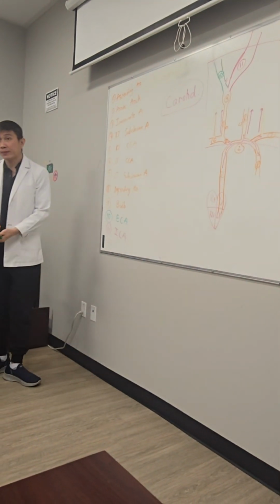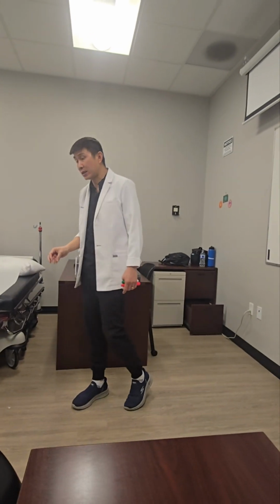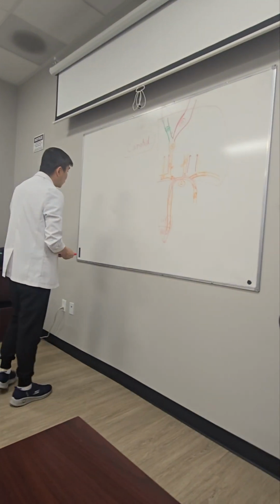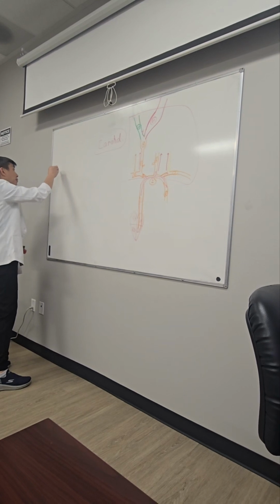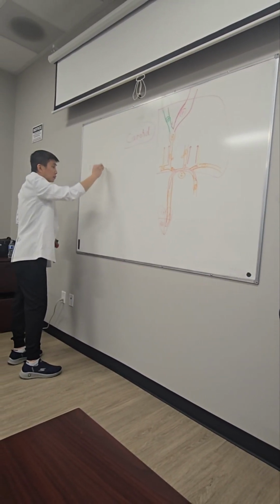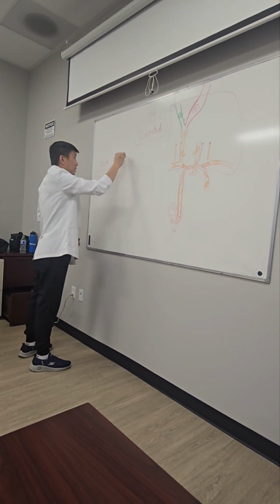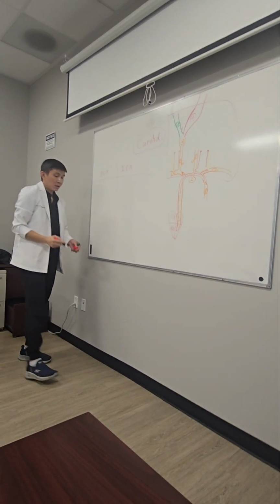So to differentiate between the ECA and ICA, I'm going to help you. We have the ECA here, and we have the ICA here.